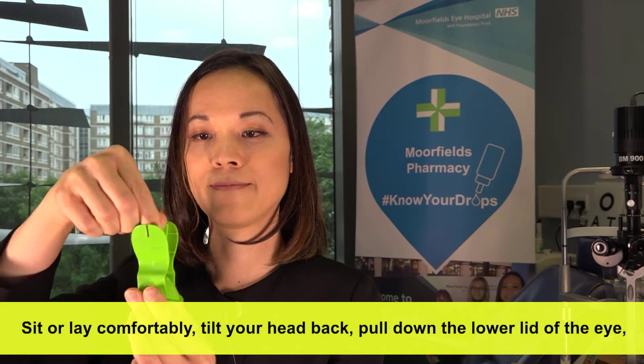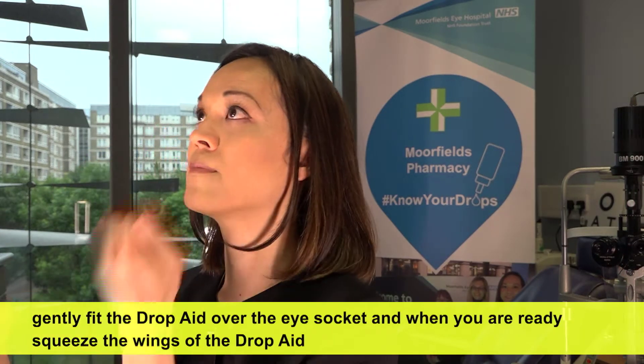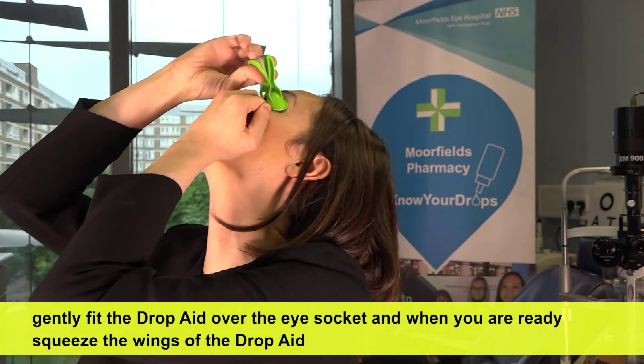Sit or lie comfortably, tilt your head back, pull down the lower lid of the eye. Gently fit the DropAid over the eye socket.